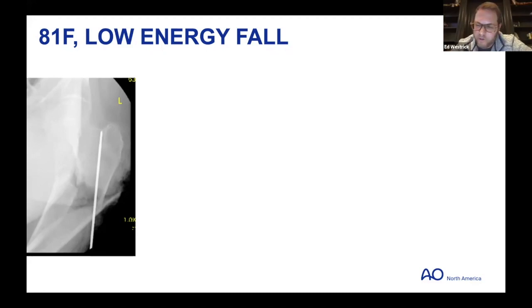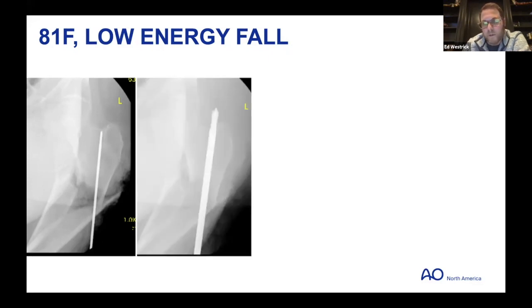We'll bring this full circle with one of the later cases too, another example of what Jeff's talking about. But again, this is an easy trick. This is the same opening guide wire, through our incision for the open reduction, placing the guide wire up the intramedullary canal, heads straight for the piriformis fossa. So we easily pass the wire. It takes 1 second. And then, this is the opening reamer, the 8mm reamer. So we over-ream the guide wire, establish the start point. And so we know 100% that that is the correct, perfect piriformis fossa start point.